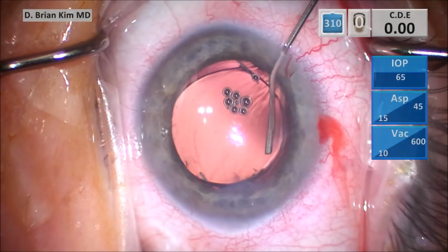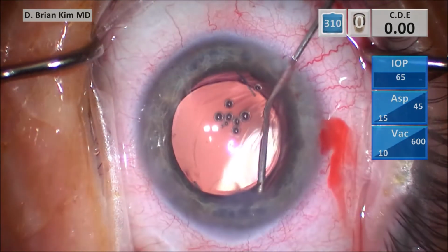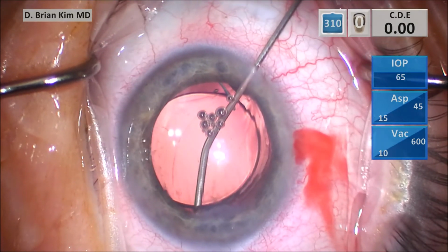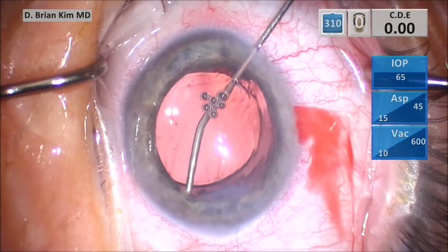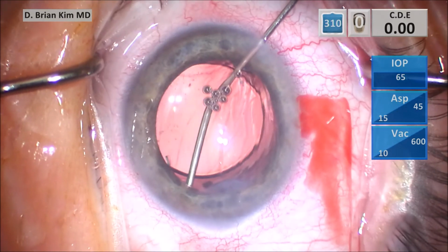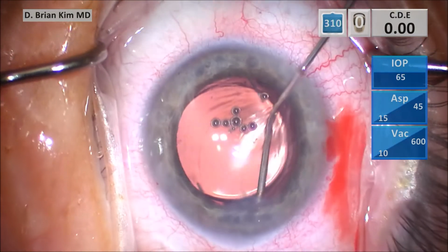So I'm using BSS to kind of push and try to create a little bit of separation between the anterior and posterior capsule. And I do wonder if I should have just gone ahead and pushed viscoelastic in at this time. I suppose I was trying to make this as elegant and as quick as possible, because if I put viscoelastic in, then I'd have to go and remove the viscoelastic again.